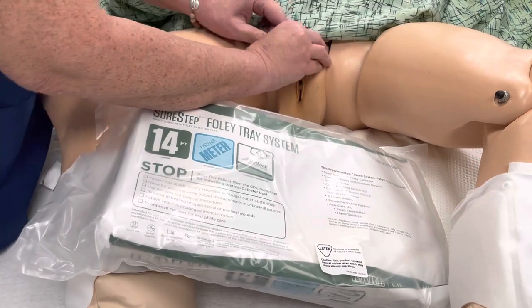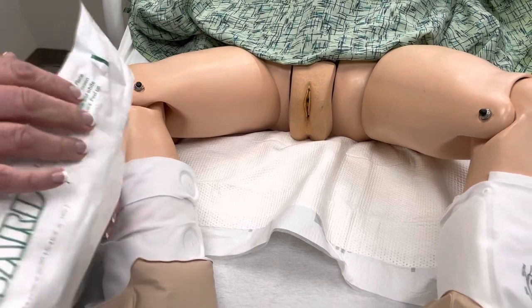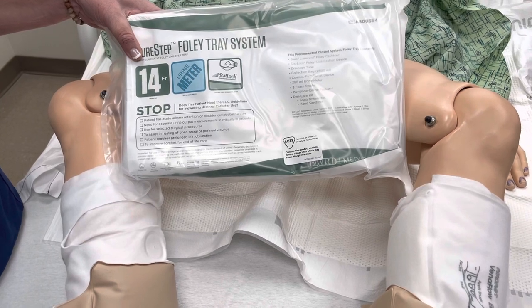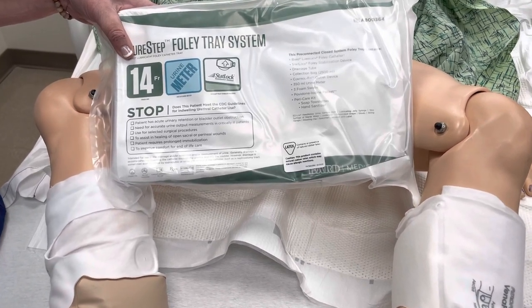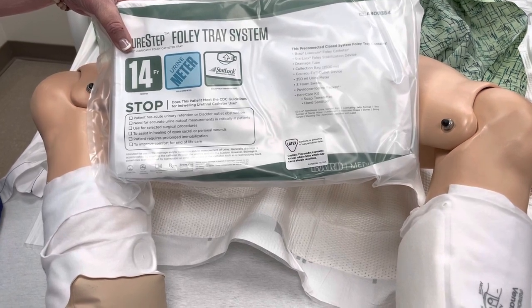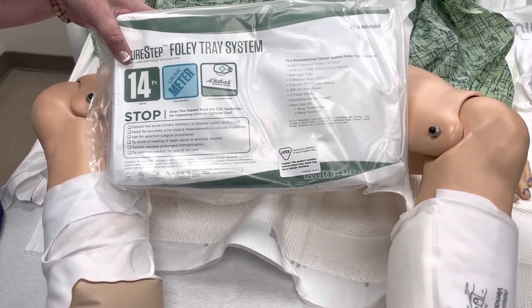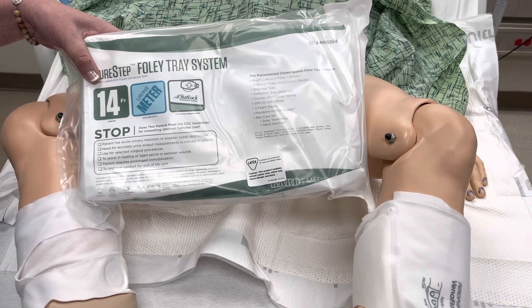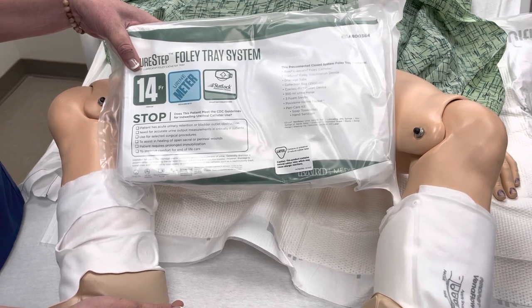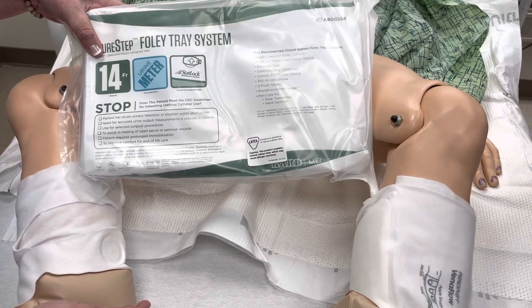When you're getting your supplies, you may want to get a couple of additional things. For instance, if you do not typically fit into the gloves that are pre-packaged in these kits, you may want to grab another set of sterile gloves — typically sized seven and a half or larger. You should only need one pair, but you may want to stick an extra pair in your pocket. It depends on what kind of catheter you're putting into your patient, because typically what we see packaged in these are going to be straight tip catheters, most often 14 to 16 French. However, if you're putting a catheter into a male patient, oftentimes we're going to use a Coude tip catheter.